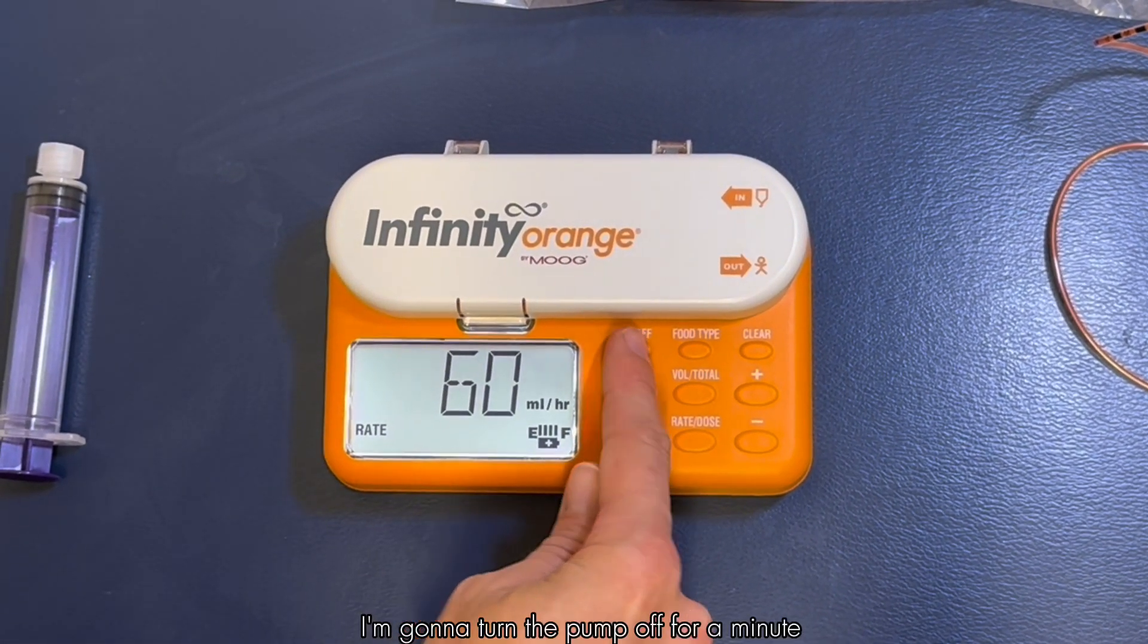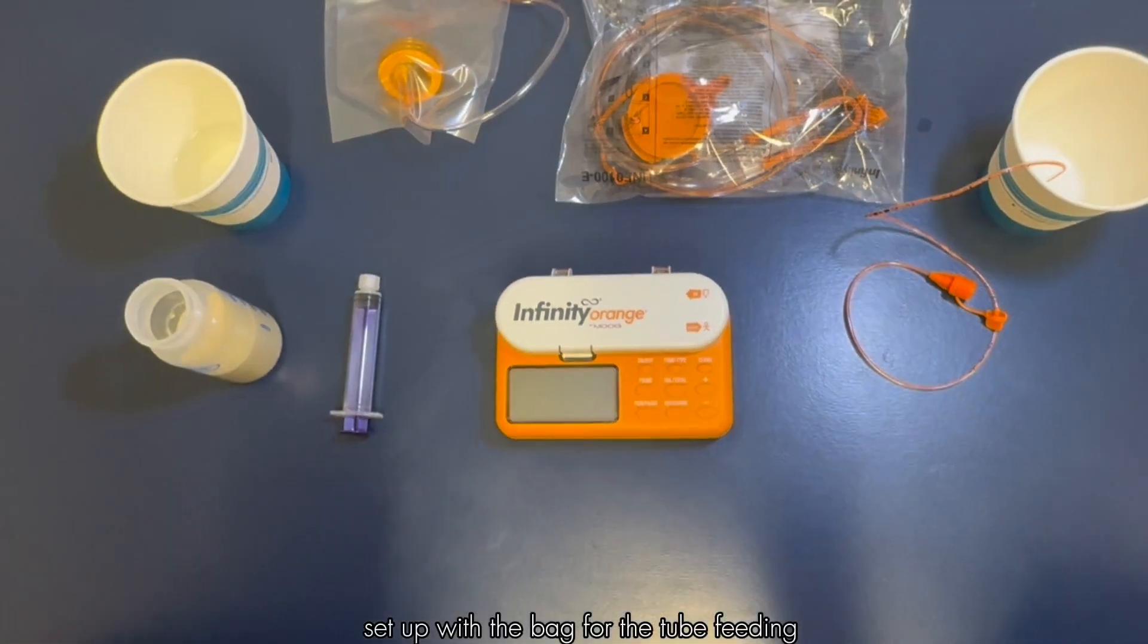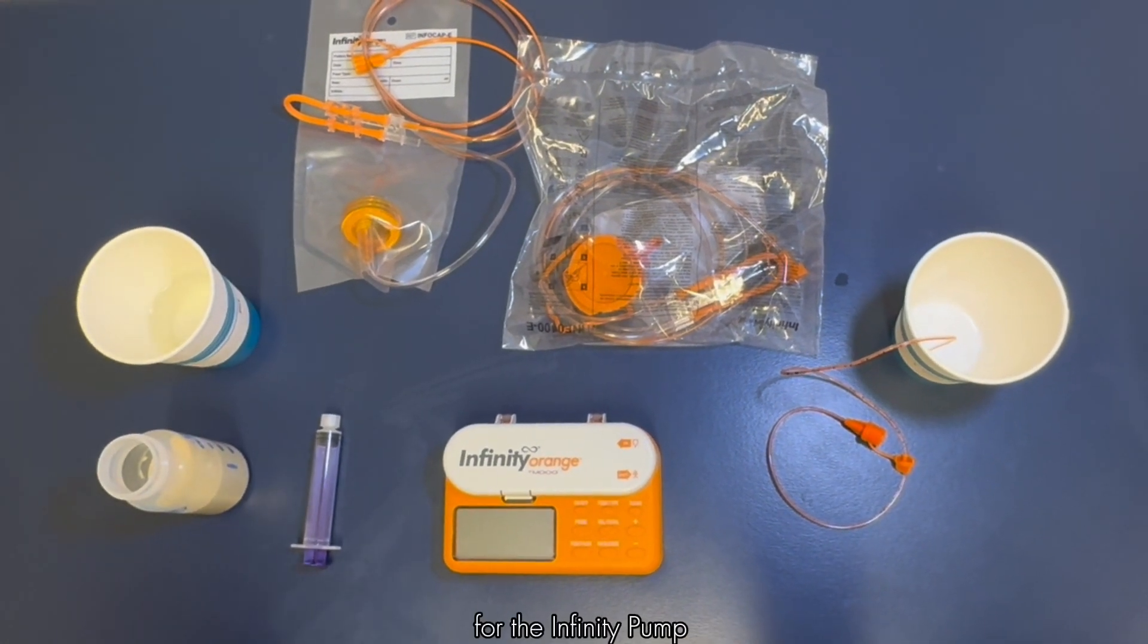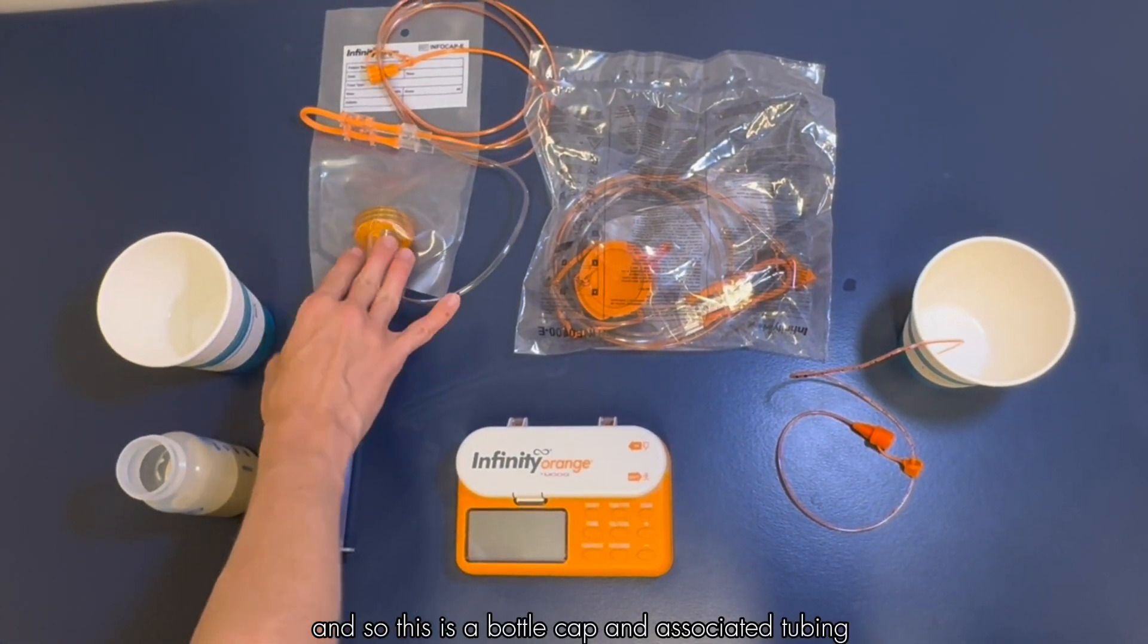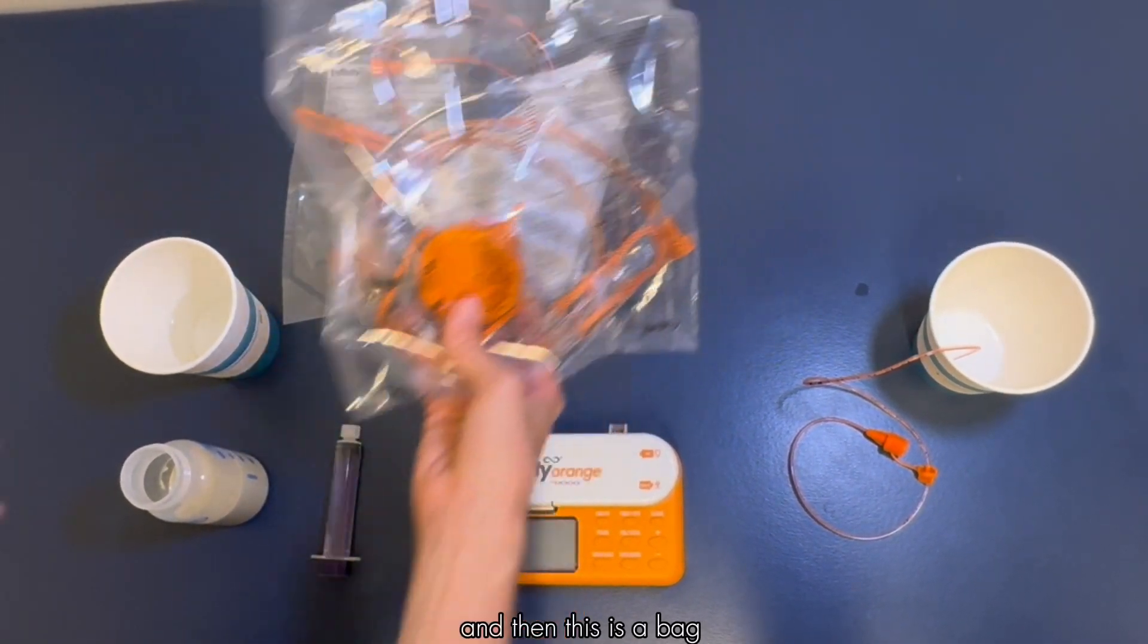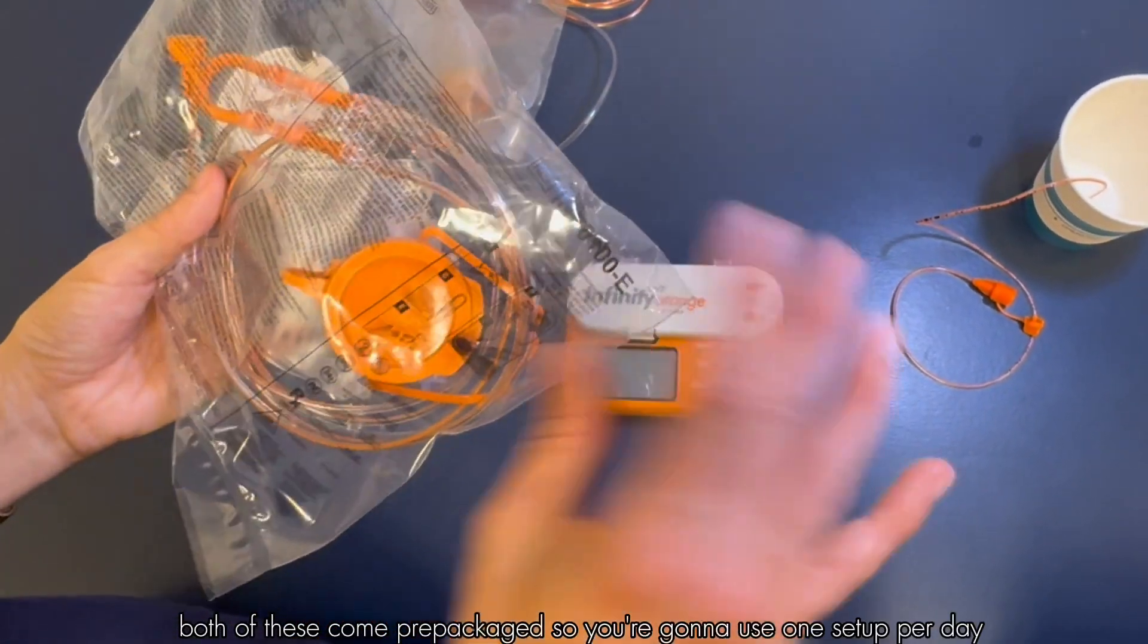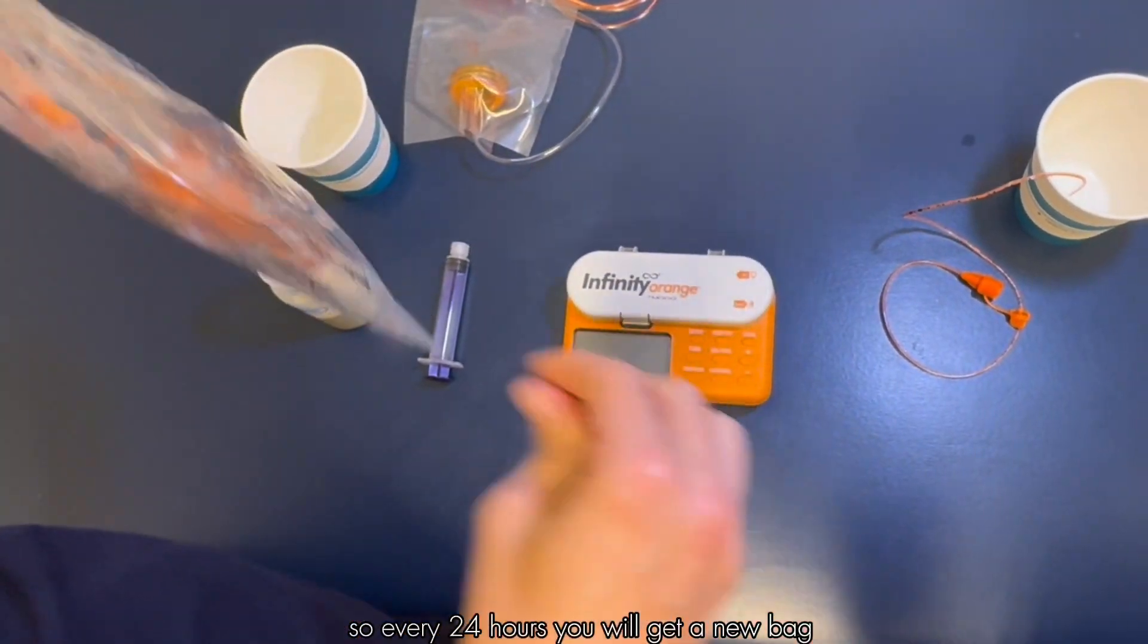I'm going to turn the pump off for a minute and then we can work on getting everything set up with the bag for the tube feeding. There's a few different kinds of bags that you might use for the Infinity pump. This is a bottle cap and associated tubing, and then this is a bag. Both of these come pre-packaged so you're going to use one set up per day, so every 24 hours you would get a new bag.